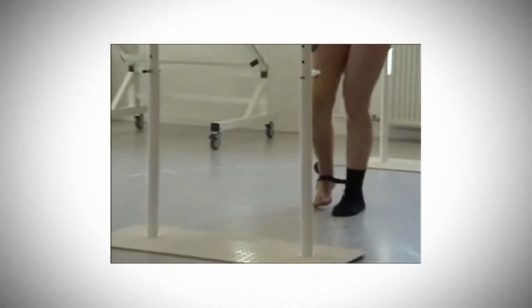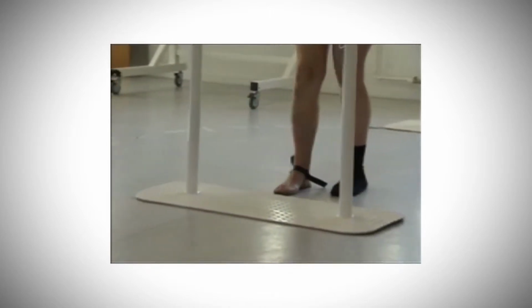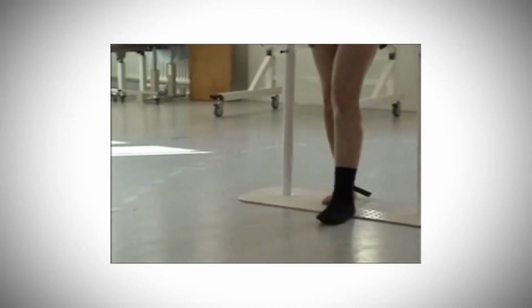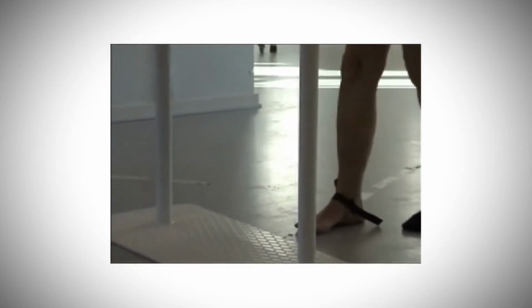And so we then worked with the University of Aalborg in Denmark to develop an implanted stimulator. So instead of having the electrodes on the skin, there was one electrode which wrapped around the nerve inside the leg, and the stimulator was implanted as well. And so all they had to do was to wear a little device just on the outside of the leg and a very small box at their waist. And that didn't work any better. It didn't make them walk any better, but the patients liked it much more because it was so much easier for them to put that on.